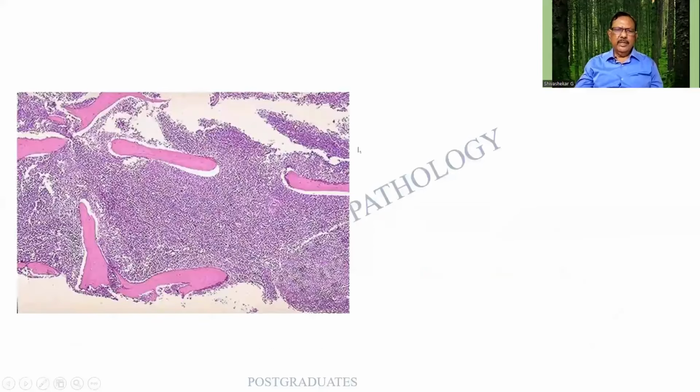So look at this. Obviously, it is 100% cellularity over here. And there are two things that we will have to consider. One, there is a suppression. I cannot see the cells or identify them. That doesn't matter at all.